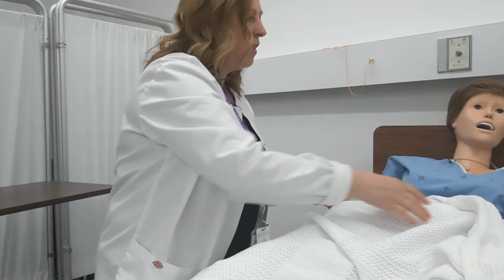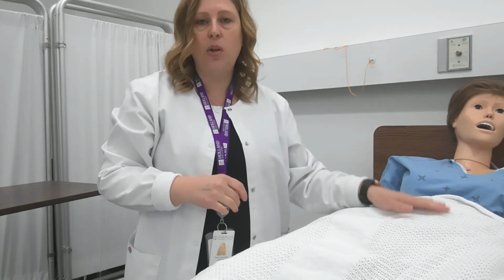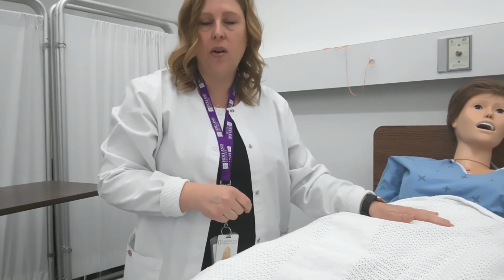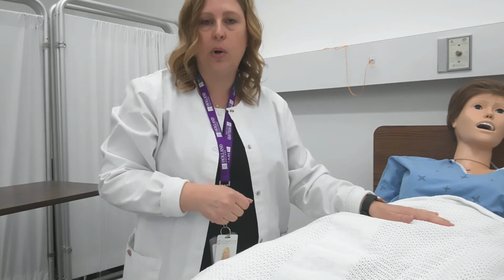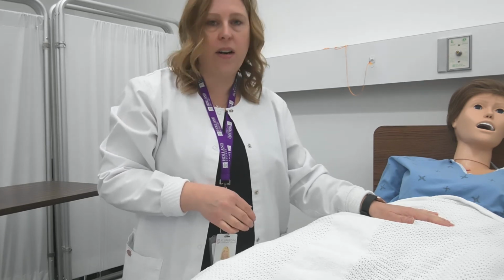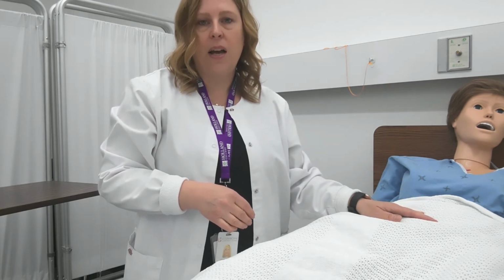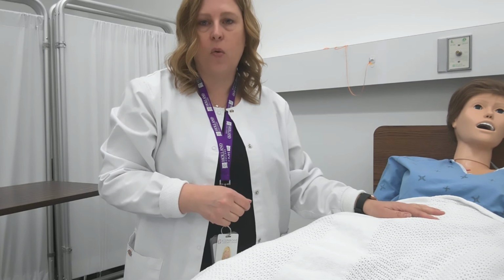I'm going to instruct them to increase their fluid intake, and then let them know that the first time they do go to void, they might have a slight burning sensation. I can use things like running water in the bathroom or running some warm water over the perineum just to help to initiate that first void.